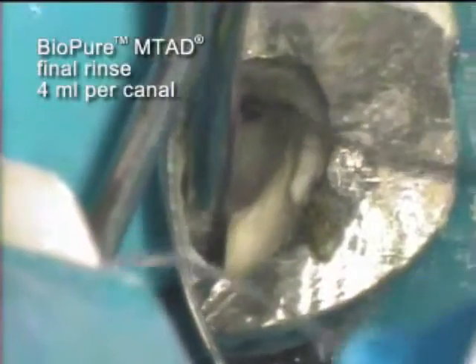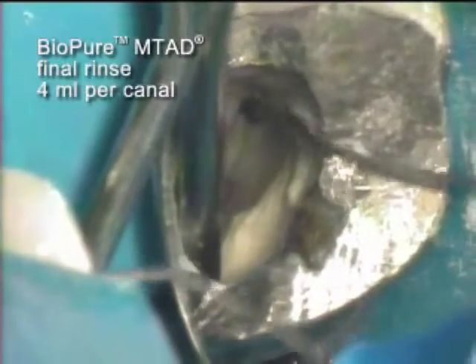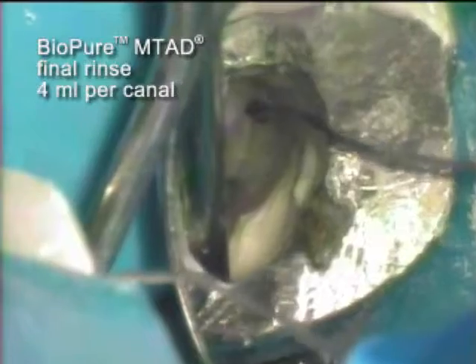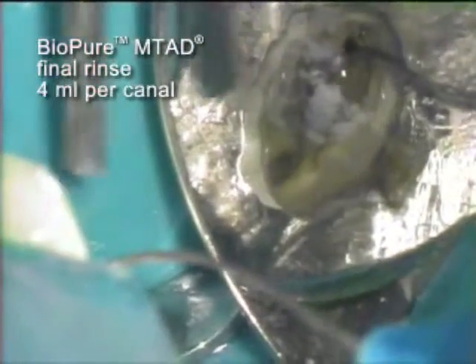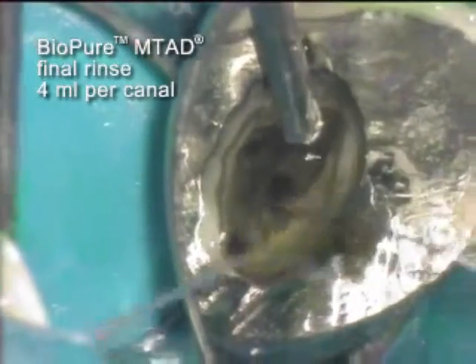After a five-minute soak, the BioPure protocol calls for a rinse. Four milliliters per canal is introduced. Another reaction can be seen during this final rinse and evacuation step.